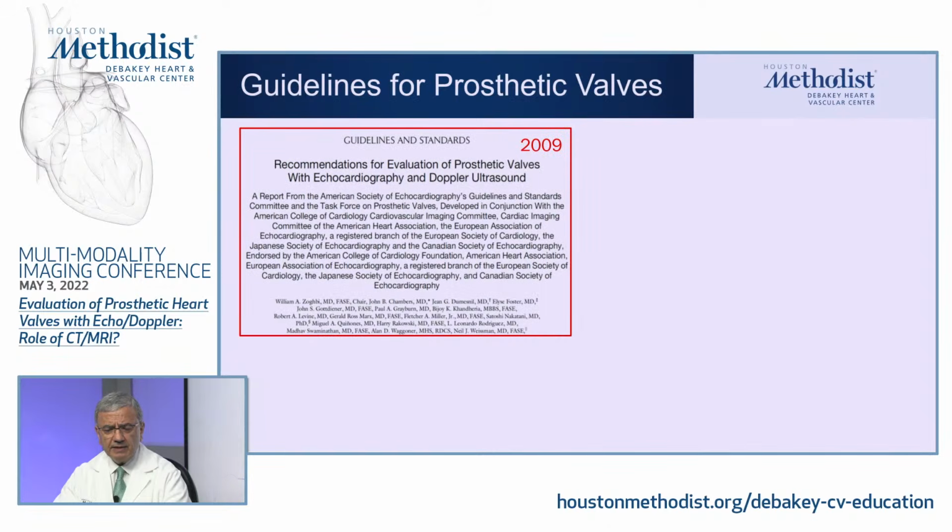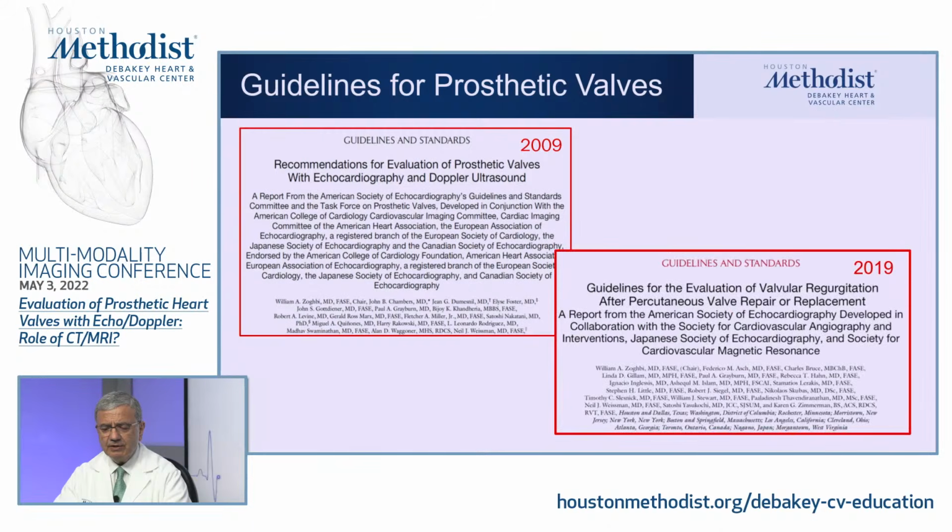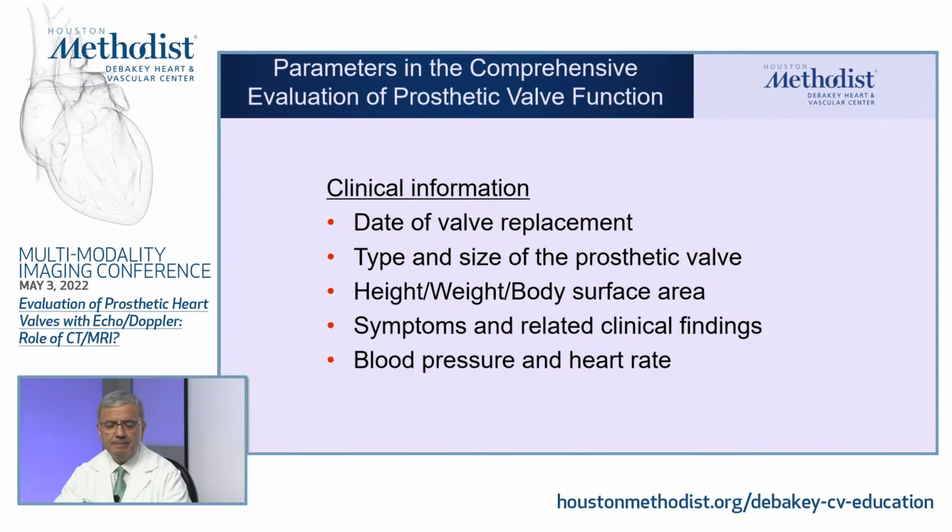These were the guidelines that I was honored and privileged to chair in 2009. You will have another revision. This is under production at this stage of the game. So hopefully you will see them by next year, and an update of these prosthetic valve guidelines, including MRI and CT evaluation. Another guideline that was published a few years ago is after percutaneous valve repair or replacement, how to evaluate regurgitation.